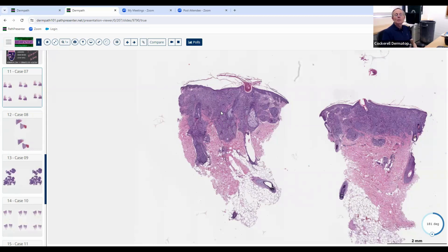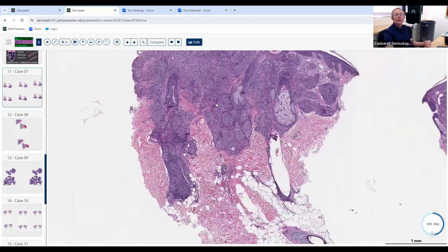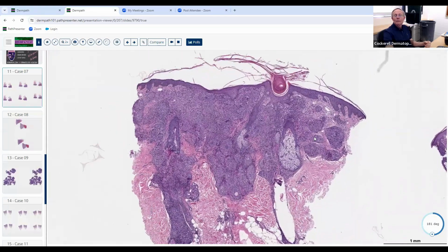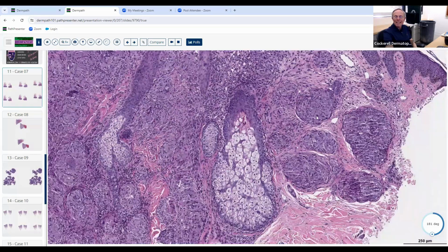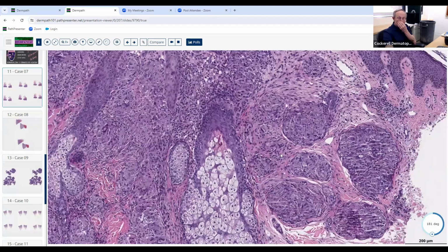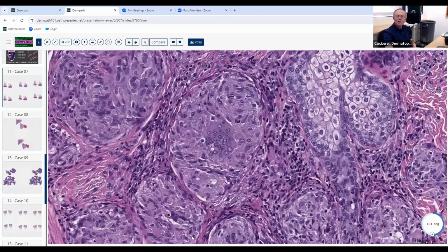And when we think of histiocyte predominance, we think of granulomatous dermatitis. And there's 5 types of granulomatous inflammation. There's suppurative granulomatous dermatitis, there's foreign body granulomatous dermatitis, there's sarcoidal, there's palisaded, and tuberculoid is the other one. Here we see sarcoidal granulomatous dermatitis. Sarcoidal, right here. These are nice epithelioid sarcoidal granulomas. Okay, so this is right down the middle of the fairway for a board examination type question. It's a beautiful biopsy. It's got classic features. It shows sarcoidal granulomatous dermatitis.